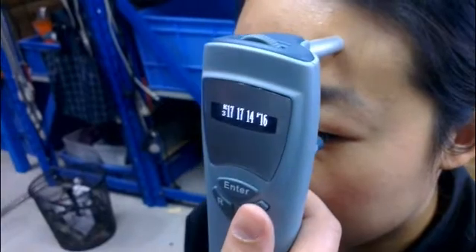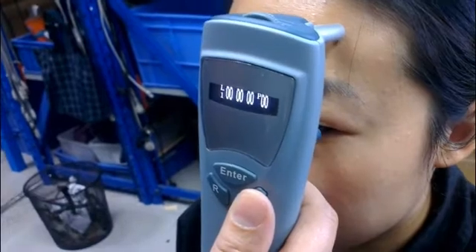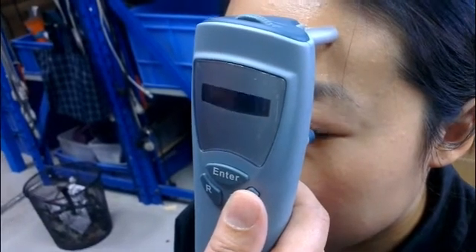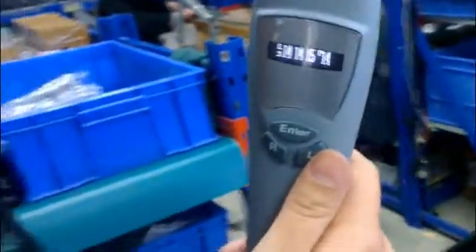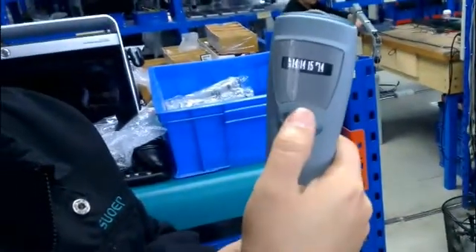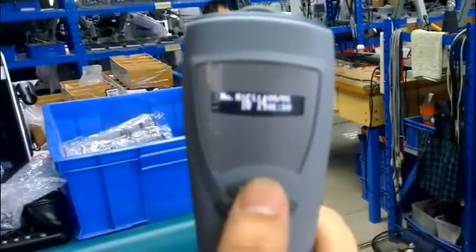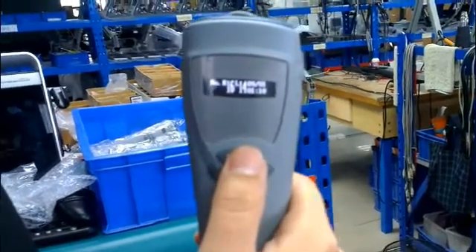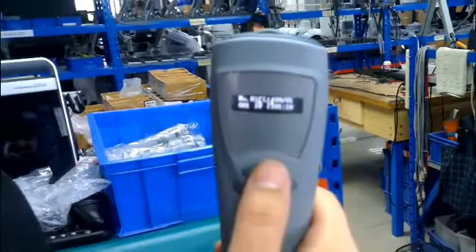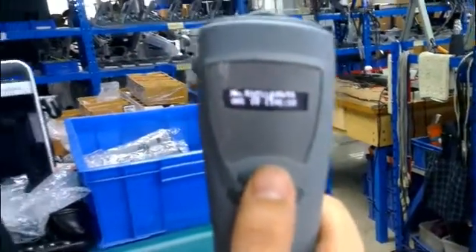Now we change to another eye. Press enter. Then you will see the data displayed on the screen. Press enter again, then we can save the data.